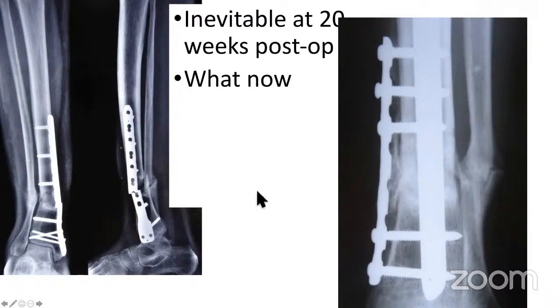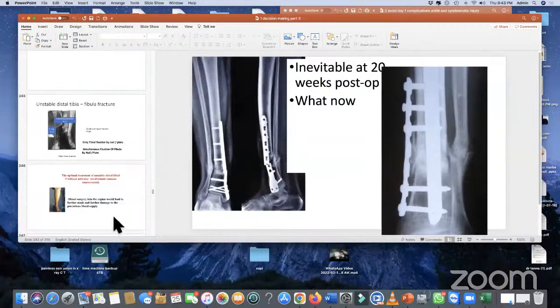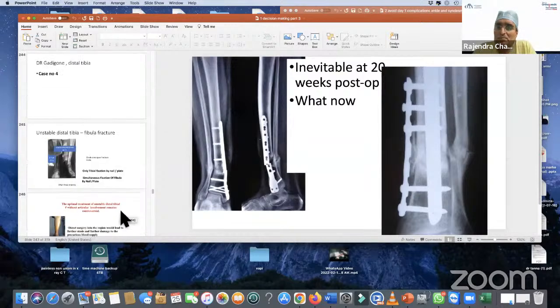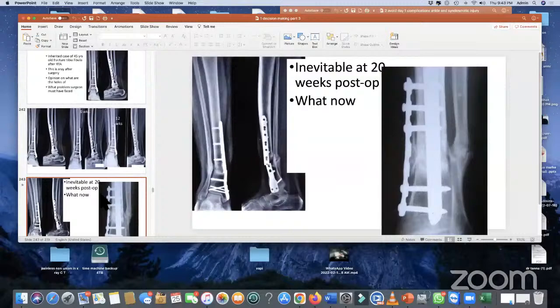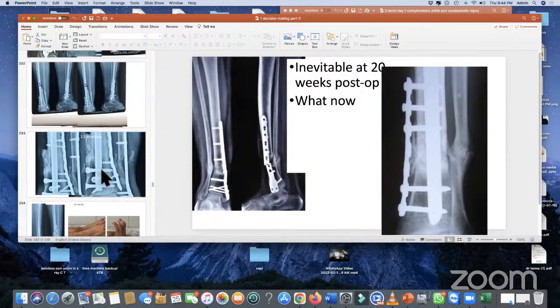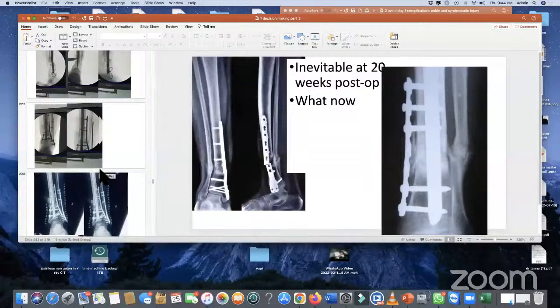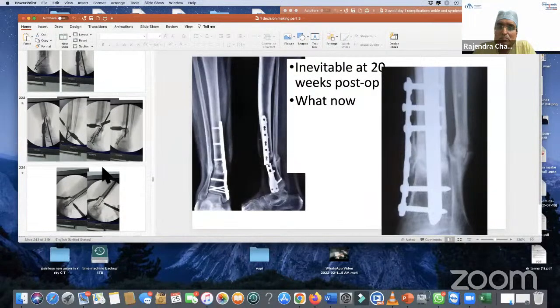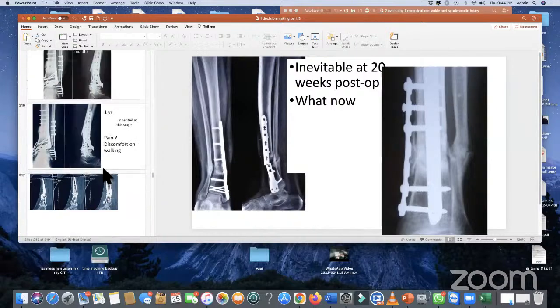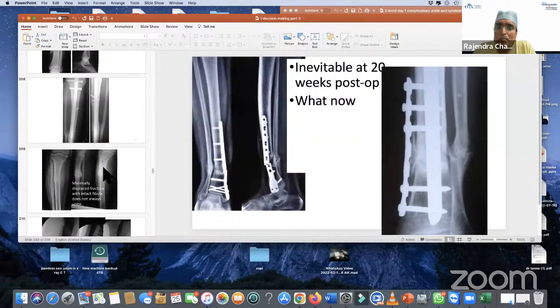fracture. Chandak sir, I want to get my idea clear here. Actually, you will find that you have used an anteromedial plate. Yes. And it's a locking plate, and therefore it is away from the fracture site. What about the skin condition? Because on the medial side, in such a non-united fracture, probably the skin becomes adherent to the soft tissues, and there is always some wound healing problem. Is there any problem of wound healing?